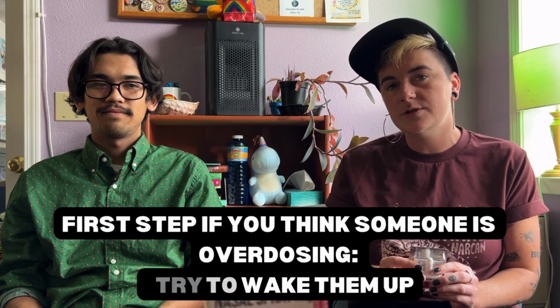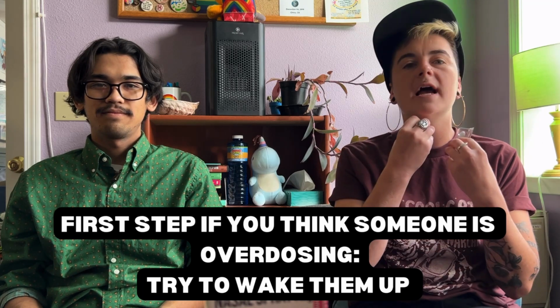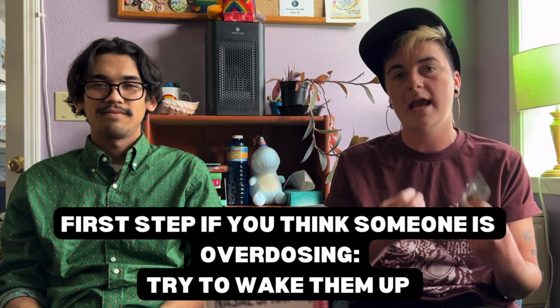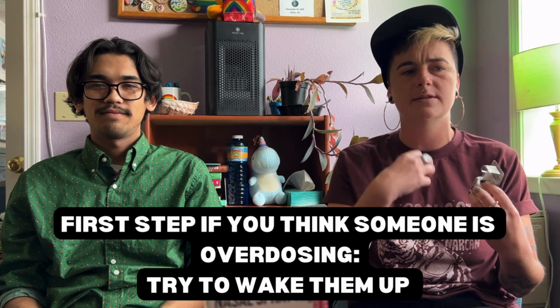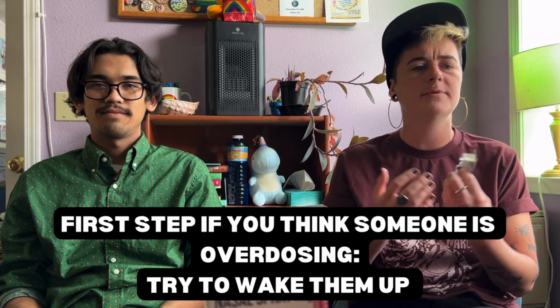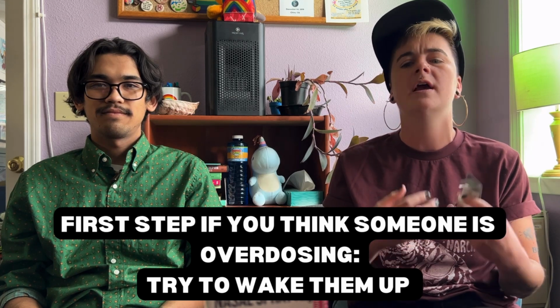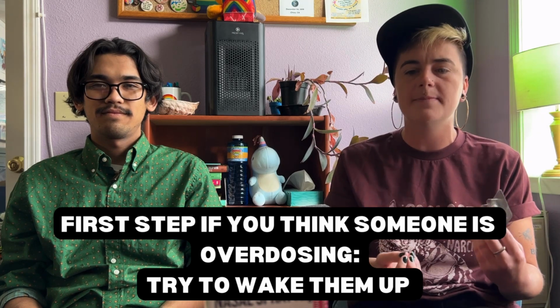First thing you're going to want to do if you think someone's overdosing is try to wake them up. Verbalize everything you're doing and narrate, right? If you see someone who's unresponsive or you feel like isn't breathing, start talking, right? Hey, I'm concerned about you. I'm walking closer. Hey, you're really not waking up. If you can hear me, can you speak back?